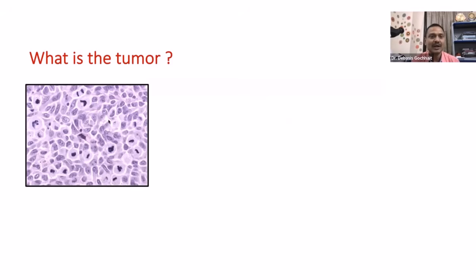Okay, so what I can say is this is a tumor and it is a malignant tumor because it has all features of anaplasia, including some very brisk mitotic count. Many mitotic figures are there, typical, atypical. So this is a malignancy. Now, if you ask me what subtype of malignancy, just by looking at the morphology, I cannot say whether this is a carcinoma or sarcoma or lymphoma or melanoma, right? I cannot categorize the tumor. I can just tell you that it's a high-grade malignancy.